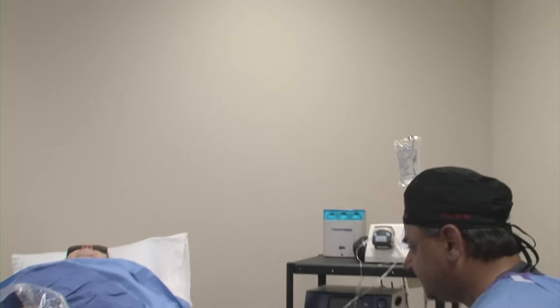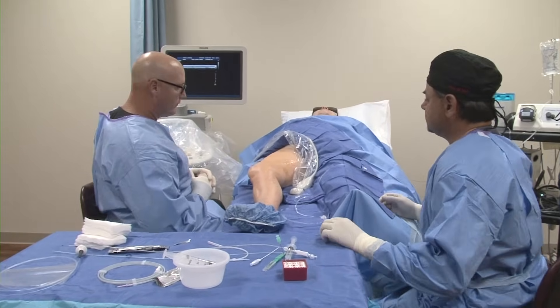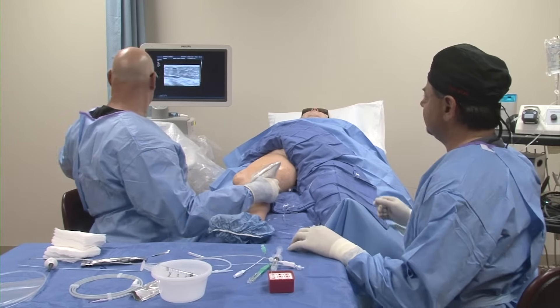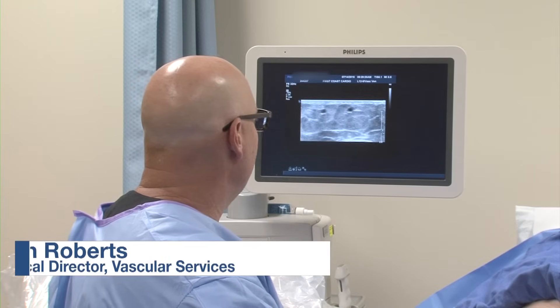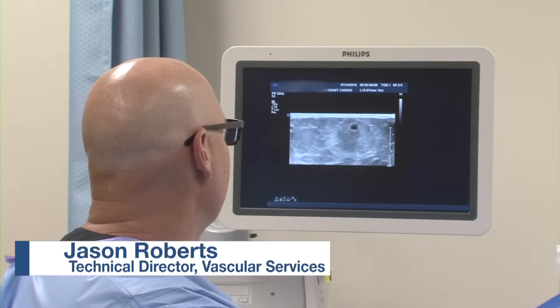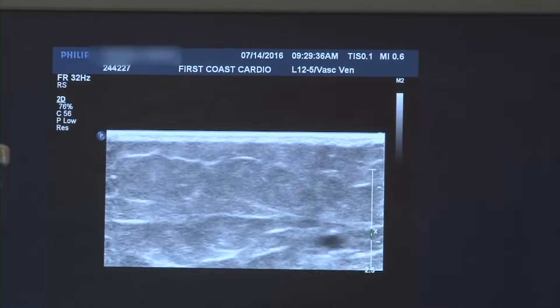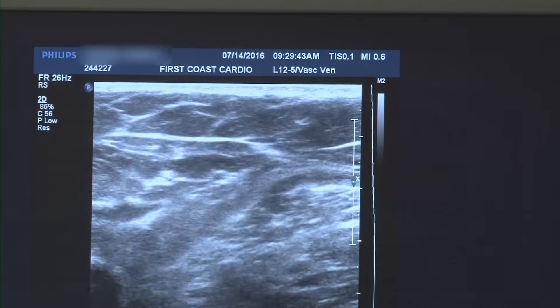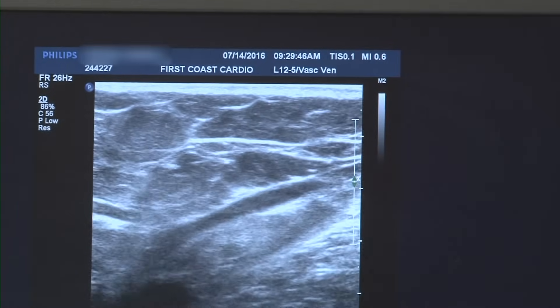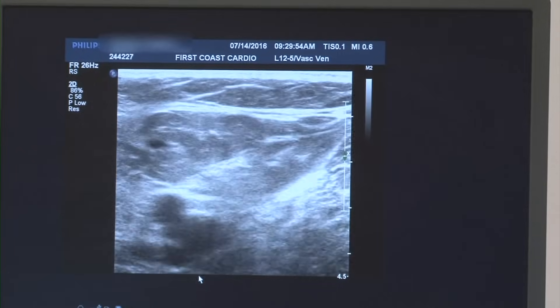So we'll begin our procedure. First, Jason is going to visualize the Great Saphenous Vein under ultrasound guidance. You can see on the screen, and Jason will point where the GSV in fact is. We need to follow the Great Saphenous Vein up the thigh and make sure that we have a good clear run, assess for any branches or any intraluminal material, phlebitis, or anything like that. We have a pretty good run all the way up to the common femoral vein, and we can see the Great Saphenous Vein as it empties into the common femoral vein at the saphenofemoral junction.